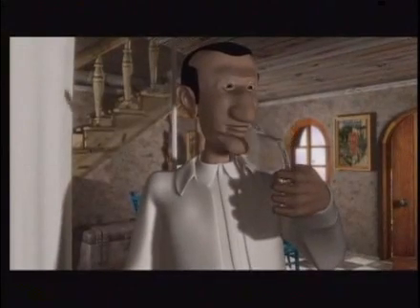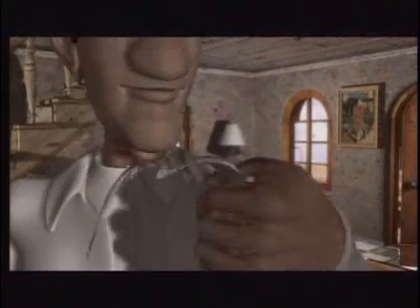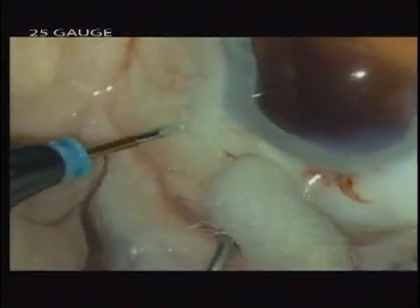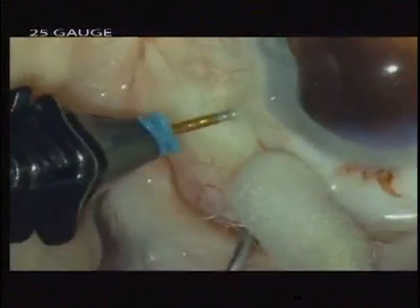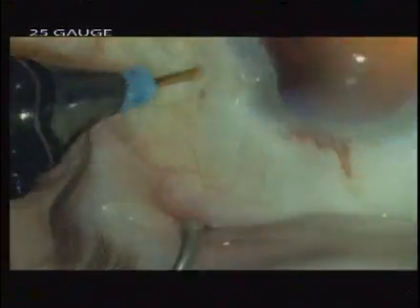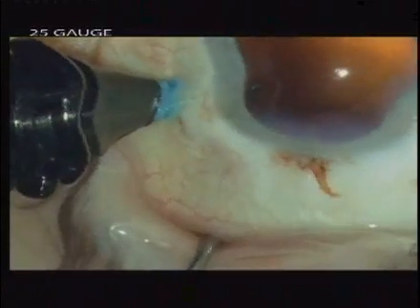The only thing is that these instruments are too flexible. Too weak. Too flexible. Don't worry — I'll try to operate you, but everything is moving. The eye is moving, and the instruments are flexible and small. How am I going to operate? I'm going to have sea sickness.